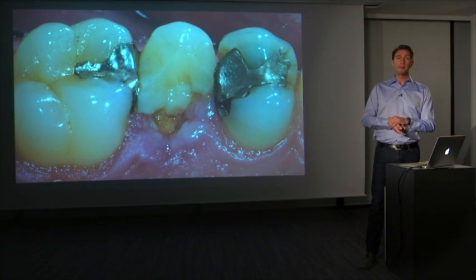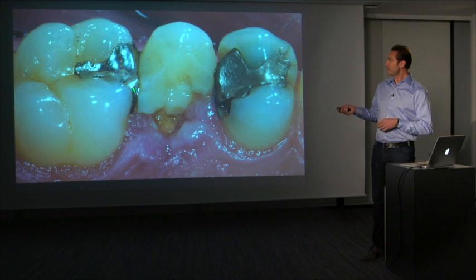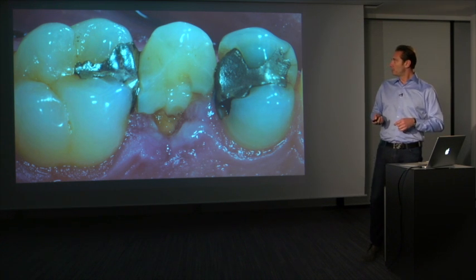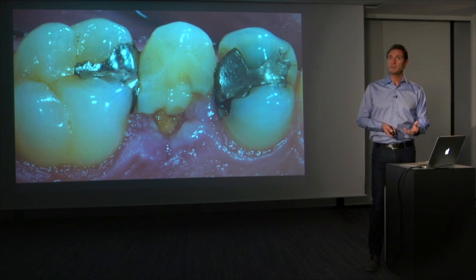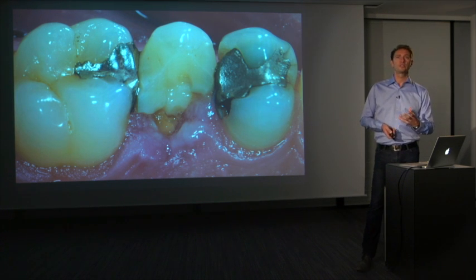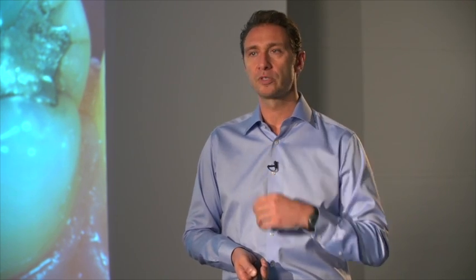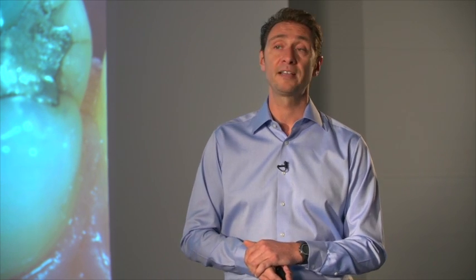Another small example is, I hate to say it, but it's my tooth, honestly. And as you can see, failure happens also with composite. We don't want to blame amalgam, but we want to show that even composite restorations fail. And especially if we don't take into account some general rules, if we don't follow guidelines in relation to preparation, in relation to cavity design, in relation to cusp coverage guidelines, I think we might have severe dramatic failure again.